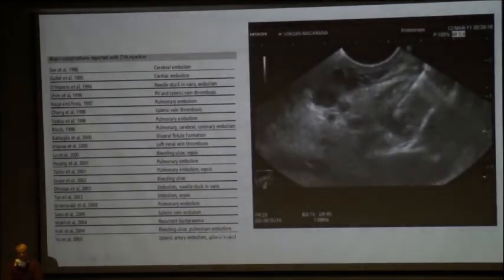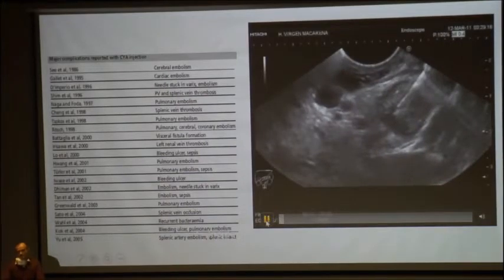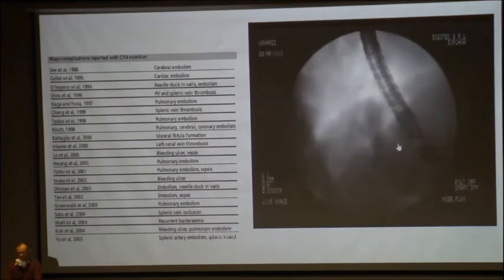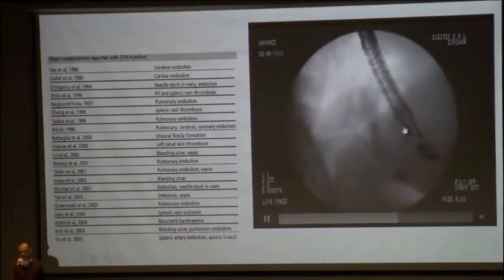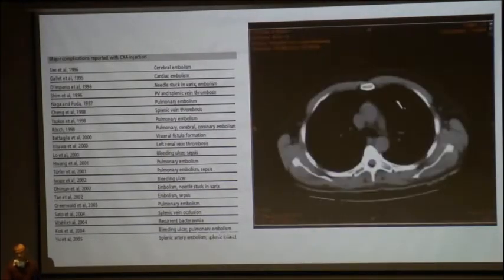There have been several case reports where EUS-guided endotherapy led to embolism in the systemic or pulmonary circulation. As an example, we can see here the glue injected into the efferent vessels, migrating through the gastrorenal shunt into the pulmonary circulation, which can be very easily seen under fluoroscopy guidance. These are the foreign bodies present in the lungs, on X-ray and CT scan.